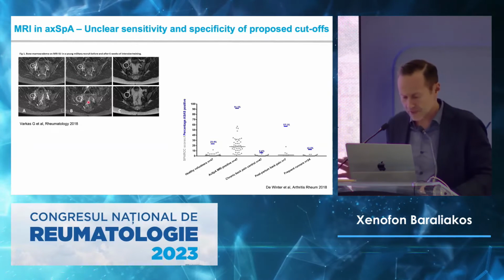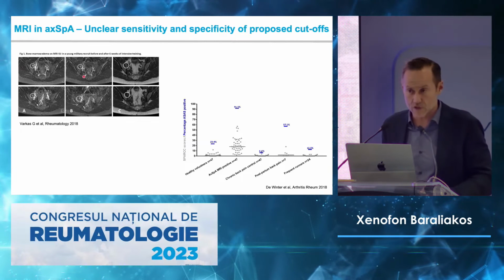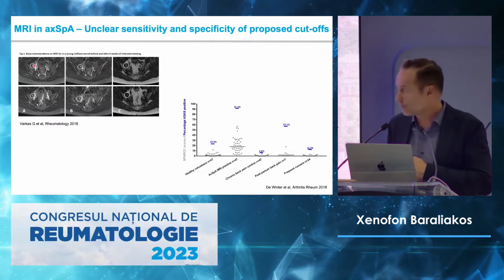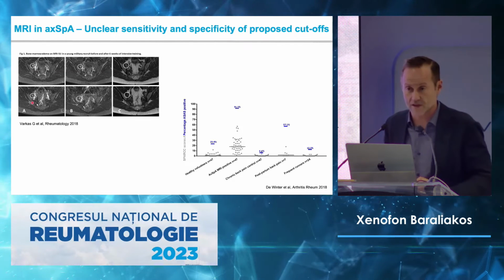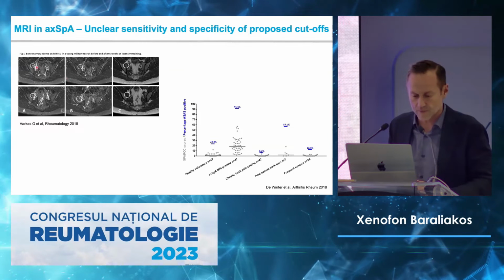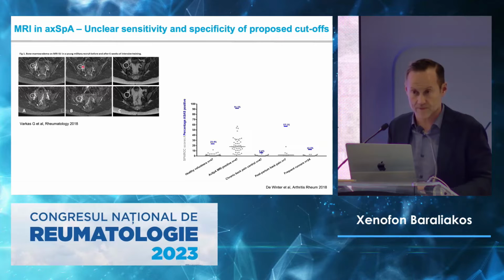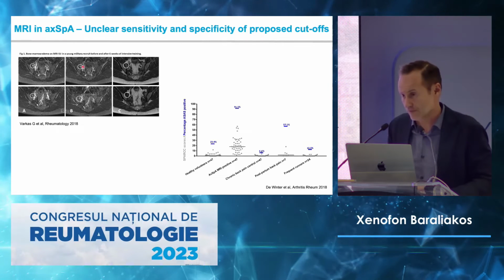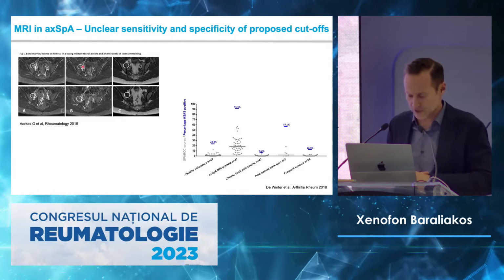I may be repeating now what was said, with military recruits who went on a long march, and they took an MRI of the sacroiliac joints of those otherwise healthy, young people. And they found edema both directly after the march, but also 6 weeks after that. So the bone marrow edema is there even if you're healthy. It's a sign of stress.